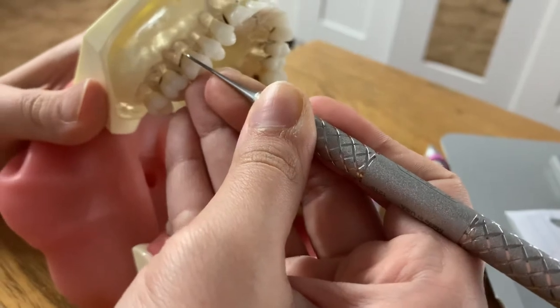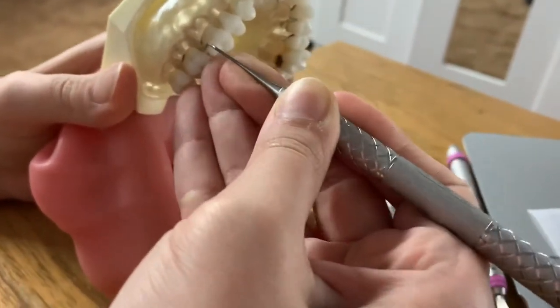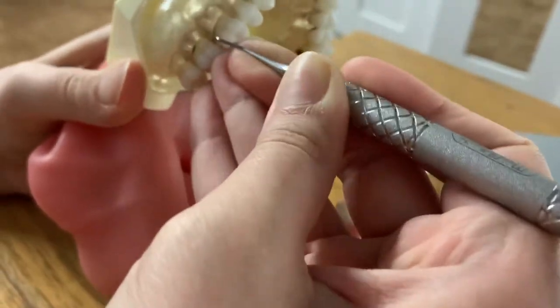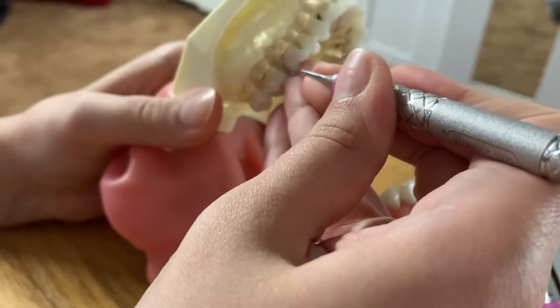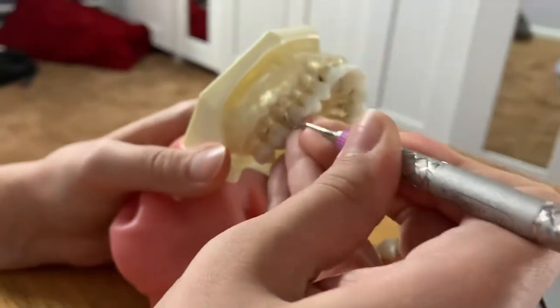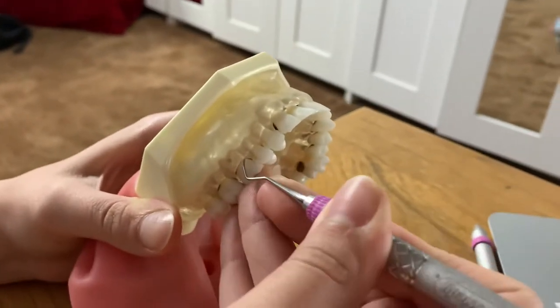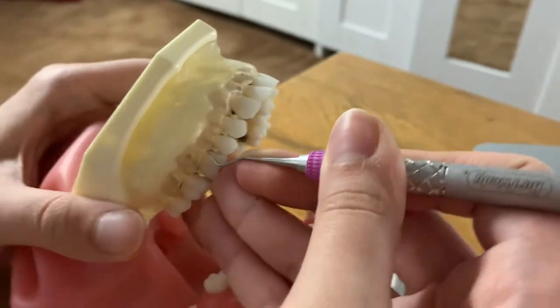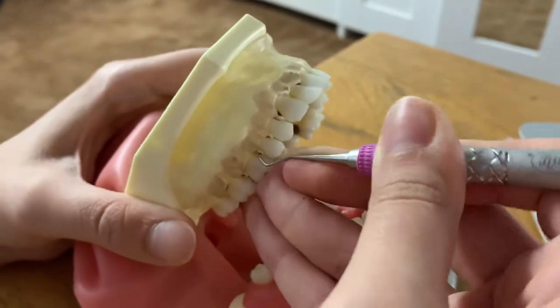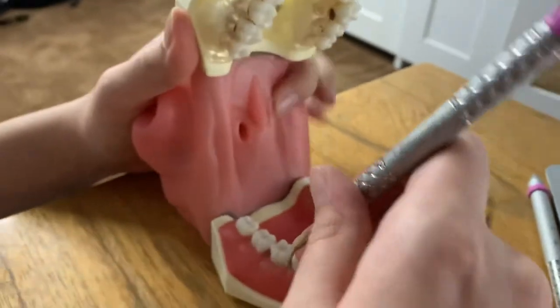I'm going to start at the distal line angle, start rocking. You can see that we're taking out the calculus and we're going to end up interproximally. Same thing for the lower right.